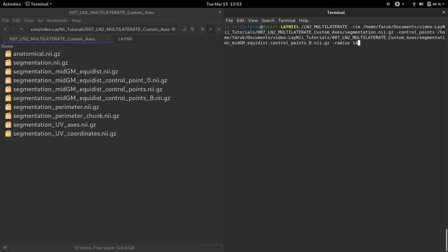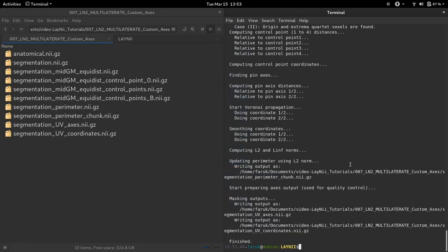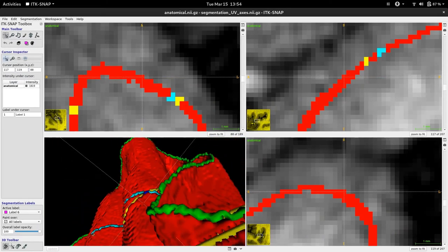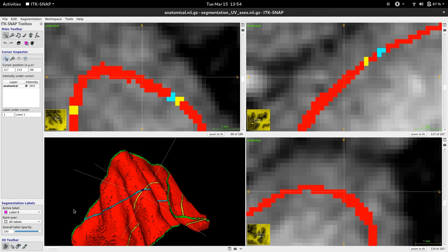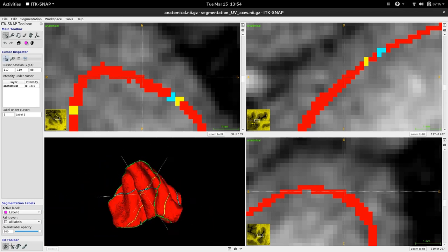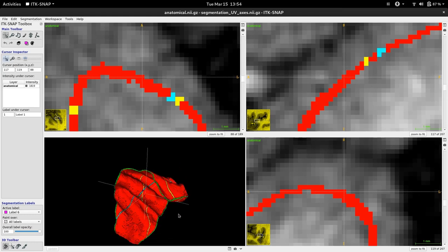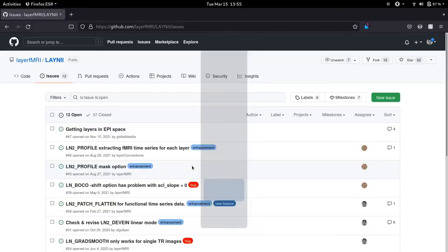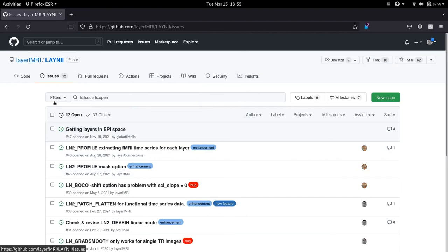Let's rerun ln2_multilaterate and see what the axes look like. The program is done and the new axis file is loaded. As you can see, the axes are found as expected. However, of course, the size of the disk looks distorted and strange — this is expected because the user has full control over the control points and how the coordinate-finding algorithm works. I do not use this custom axis option too much myself. However, if you do end up using it and have questions or problems, please visit our GitHub page, layerfMRI/LAYNII, go to the Issues tab, and submit your issue. Renzo or I will respond to your question. That's all for today, thank you.